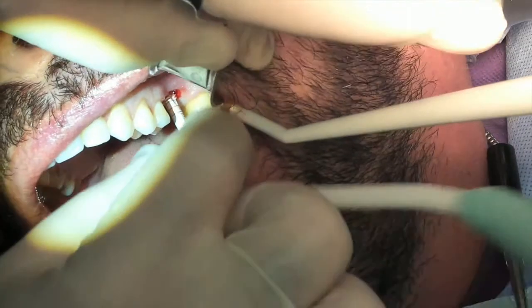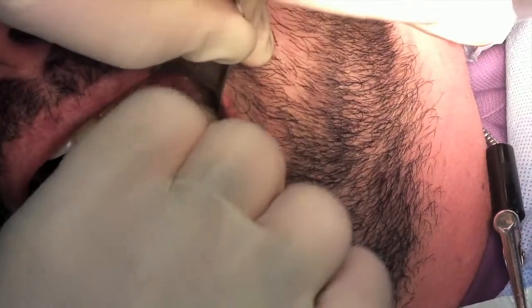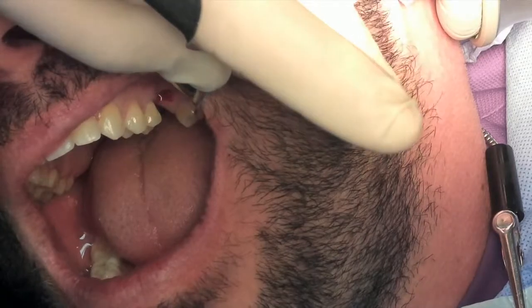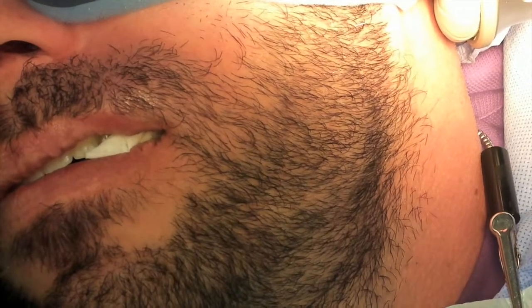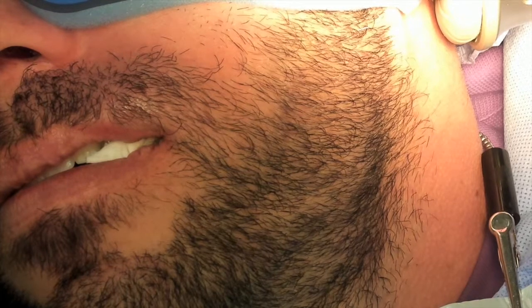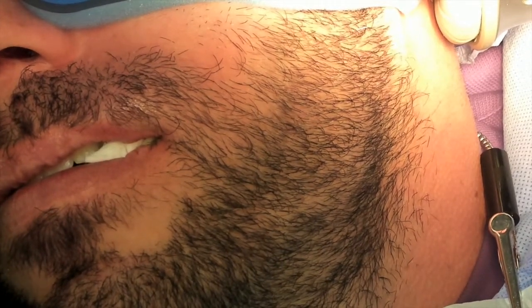Because Matt's is very, very, very dense. Now, this is a posterior. Ina, if you could get me this. Matt, down for me, thanks. And I just, you know what, Blake, I don't want to bind. I don't want the implant to bind when I'm seating it. And if I do, I take it out and I'll put it in again. But I might have to widen the site. But this is so dense, it's almost like mandibular arch, to be honest with you.